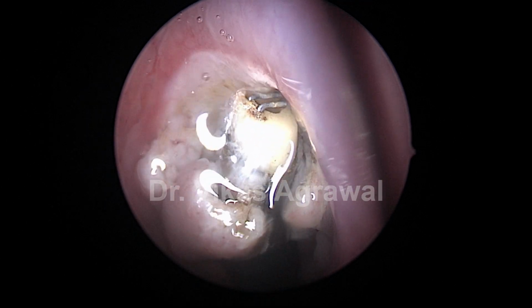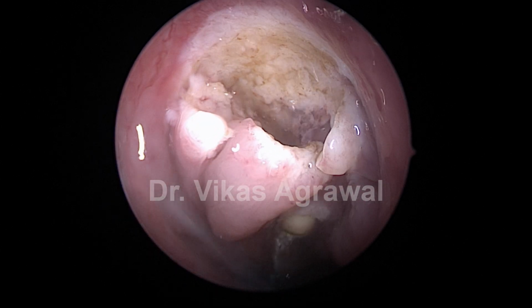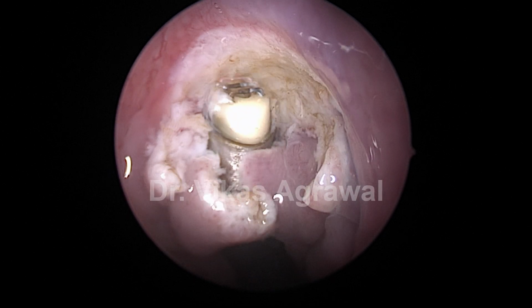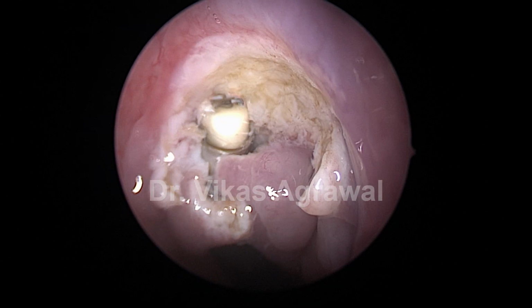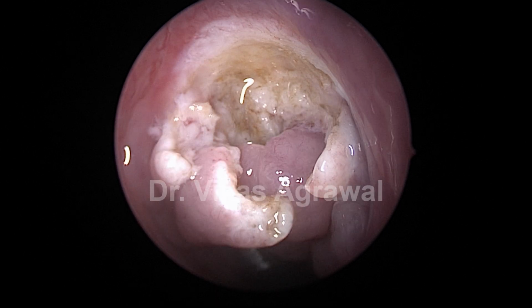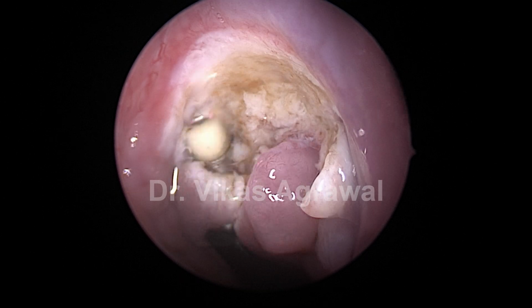which is the periosteum below the sphenoid bone. Now that's the superior boundary, which is defined into the anterior part of the superior boundary. Now let me debulk more of the adenoids and then I'll be able to define the rest of the boundaries.